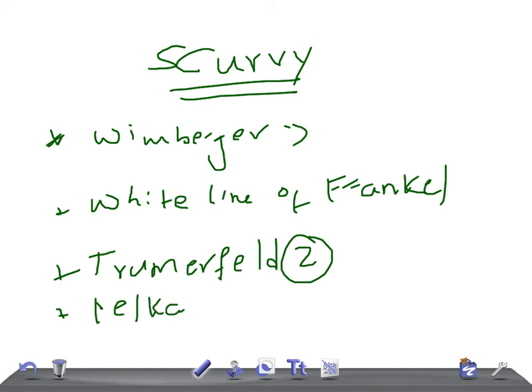Then we have another one known as the Pelkan spur. The Pelkan spur is an area prone to fractures, manifesting at cortical margins. Remember, cortical margins. These patients with scurvy are also prone to osteoporosis and periosteal hemorrhages. This is about scurvy and its radiological signs. Thank you so much for watching this video, guys. Take care.